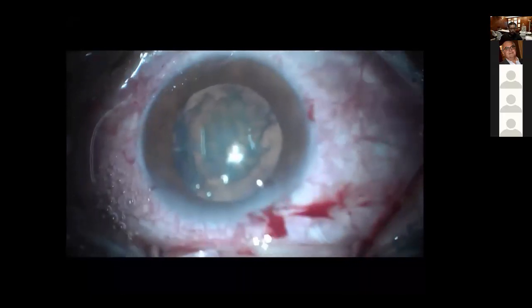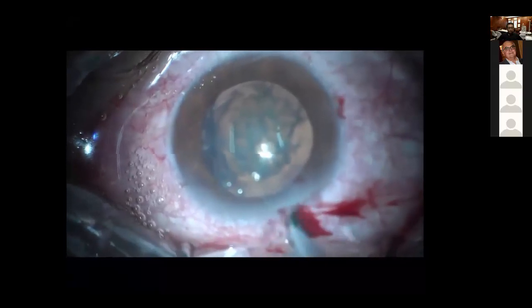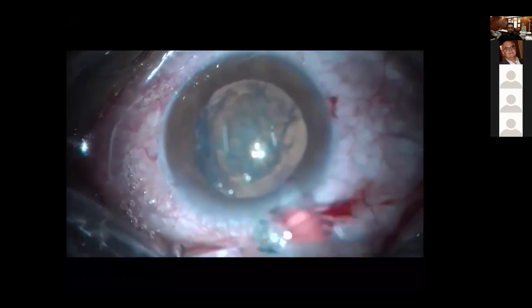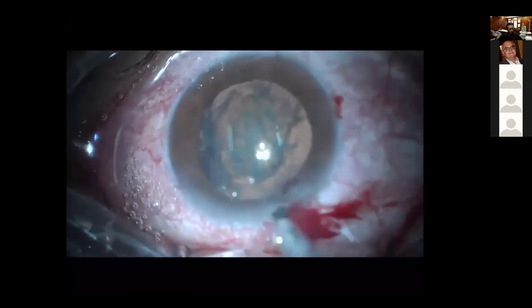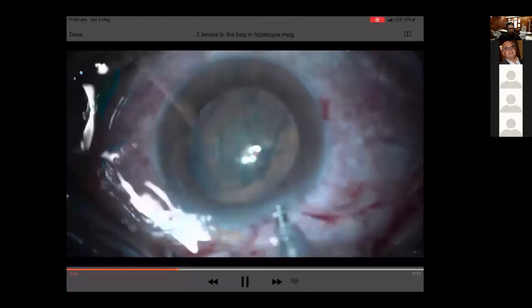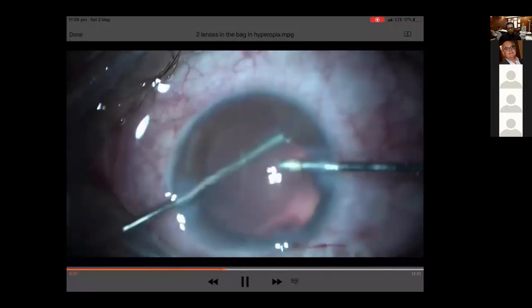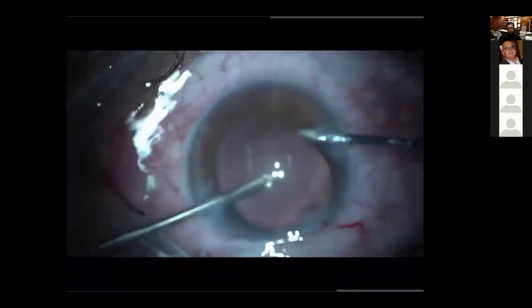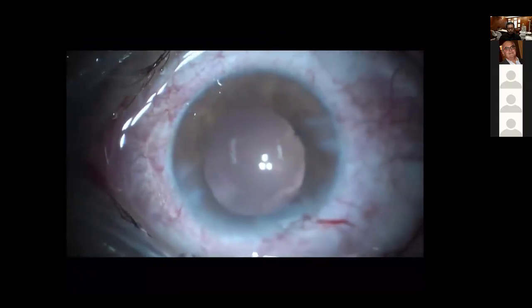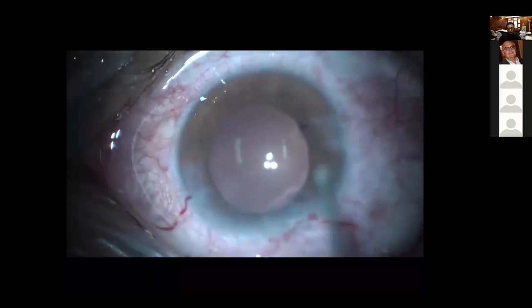Again, the lens here is not quite dense, so it can be removed using only the Phaco machine without using a second instrument or a chopper. The use of a chopper might be only in order to aid in performing the surgery. Otherwise, you can swiftly and easily remove the nucleus in such cases. And then comes the difficult part in placing the intraocular lenses, both one after each other.